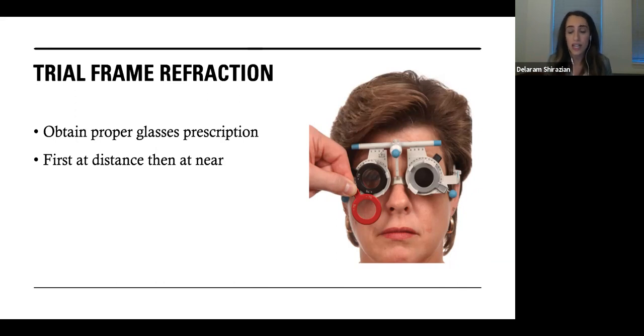One thing a lot of times I will say is sometimes people are disappointed because they come in and think that they just need a new prescription and everything's going to be okay after they get glasses. It's good to know that oftentimes in order to meet visual goals, we may have to go beyond just glasses. And we'll talk about those devices in just a bit.